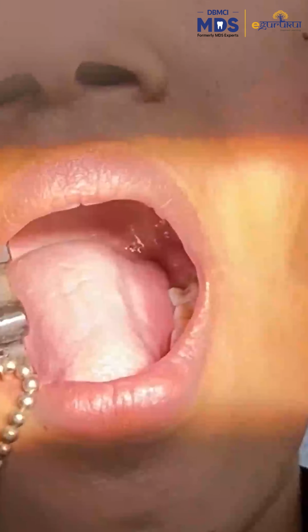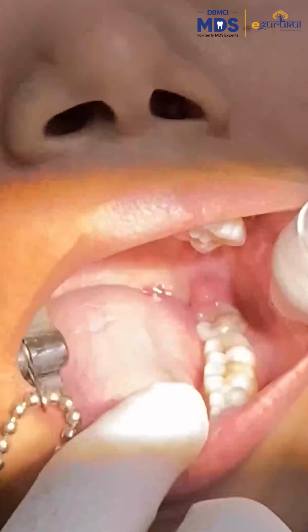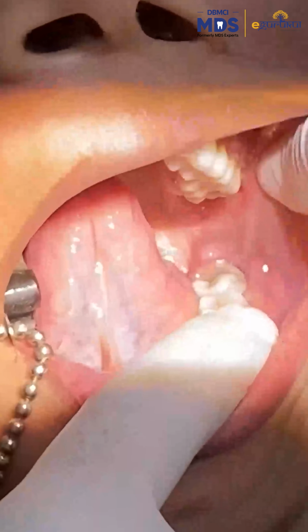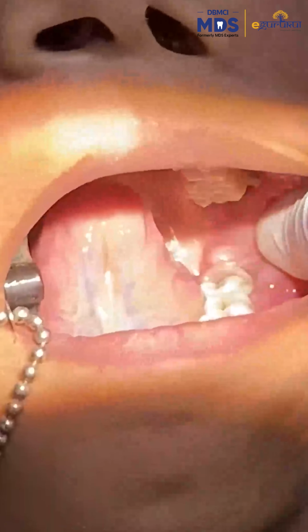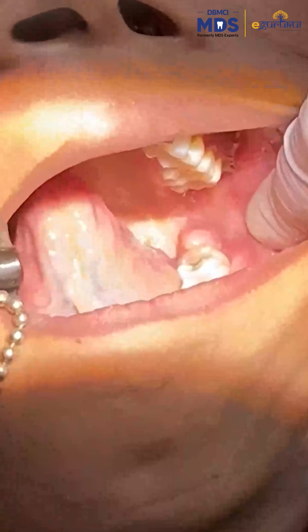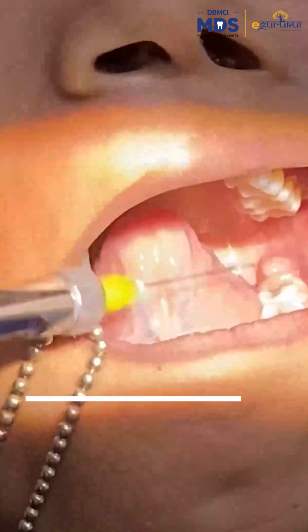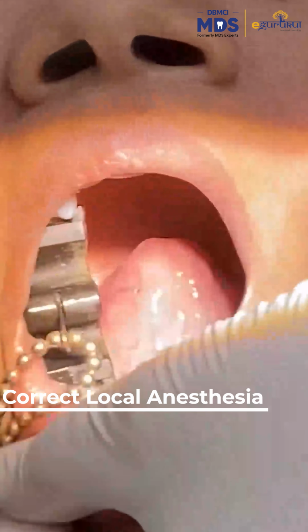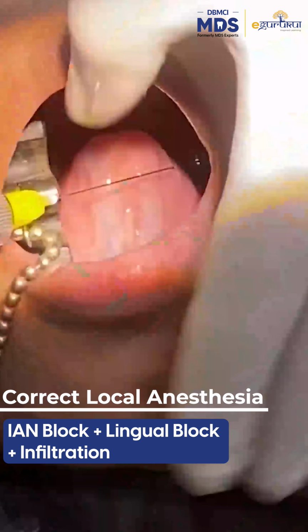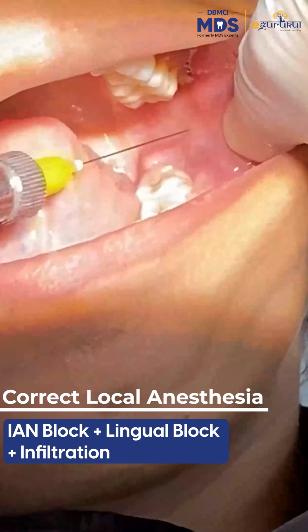So we start with the non-operating hand. If you work with your right hand, you keep your right hand free and with the left hand you palpate the external oblique ridge. The area of injection is around 6 mm above the lower occlusal level, from the opposite premolar. You can see here the opposite premolar. You start from the opposite premolar, 6 to 8 mm above the occlusal level.